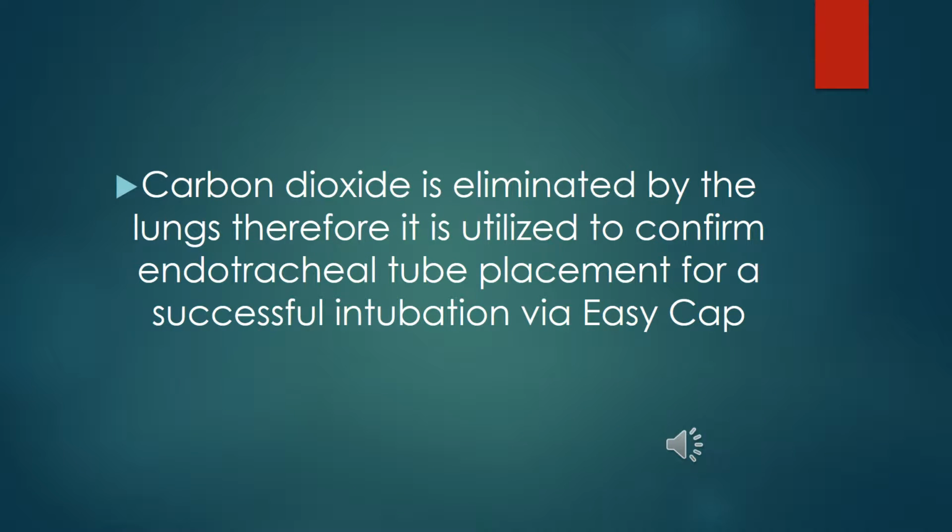Carbon dioxide is eliminated by the lungs as a byproduct of respiration and metabolism. And so it's used to confirm endotracheal tube placement via the Easy Cap, which caps onto the end of the endotracheal tube and measures carbon dioxide.